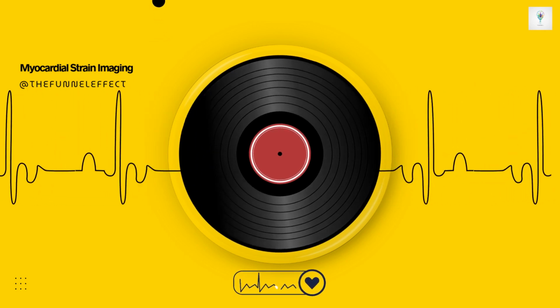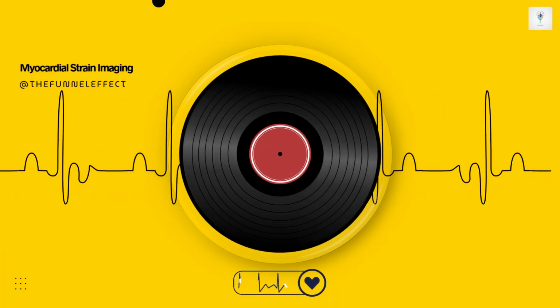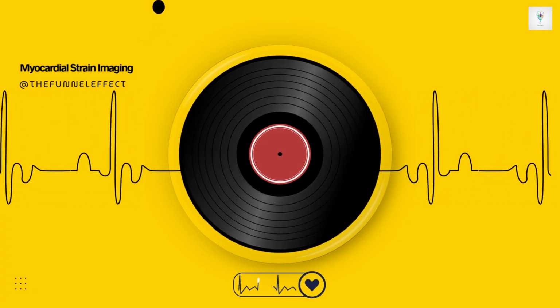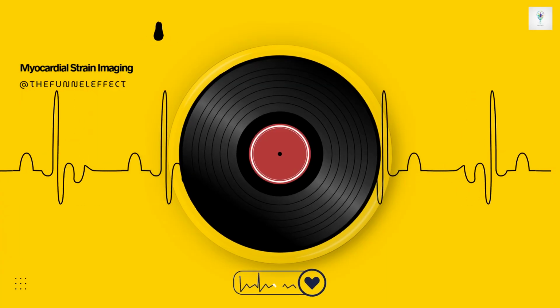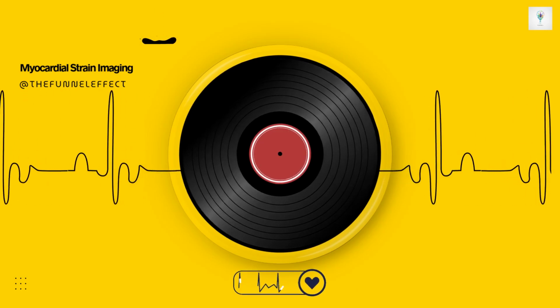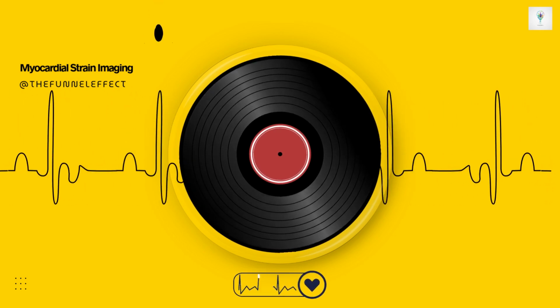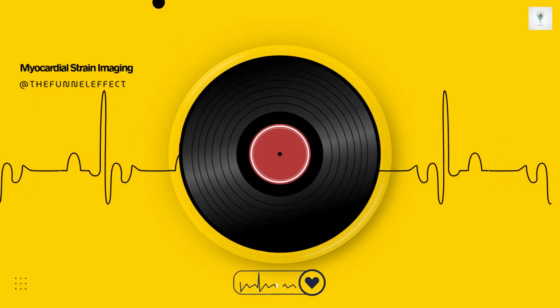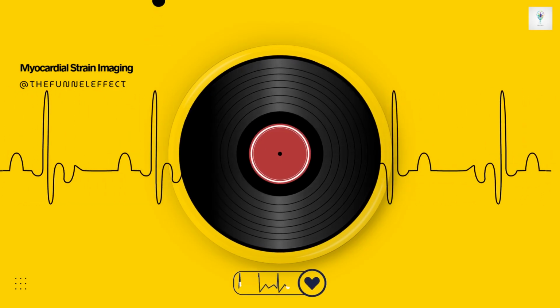Fascinating. The source mentions two other shear strains, too. What are those? They describe motion between the different layers of the heart wall itself. So circumferential radial shear measures rotational differences between the inner layer, the subendocardium, and the outer layer, the epicardium. And radial longitudinal shear quantifies differences in the long axis movement between those same inner and outer layers. Why are these less common in reports? Honestly, they're just technically quite challenging to measure accurately and reproducibly with current clinical tools. Plus, since all the heart layers are connected or tethered, the main dysfunction often shows up first in those three normal strains we discussed.